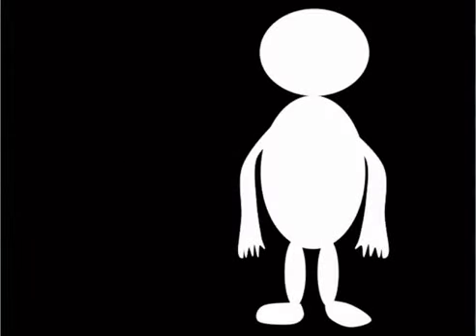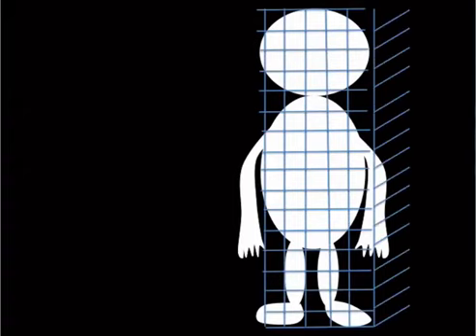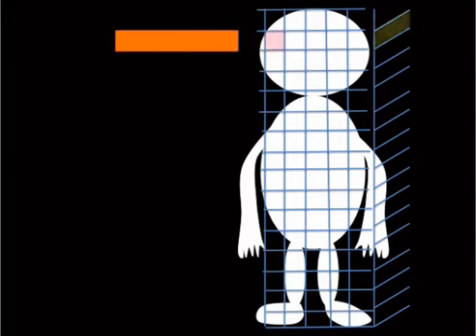So here's your body. And you can think about imaging occurring in sort of little voxels or little three-dimensional squares. You can only image each one of these individually. So there's a three-step process. Step one is to select the desired slice. Step two is to encode the spatial information along the row in that slice. And step three is to encode the spatial information along the columns in that particular slice.